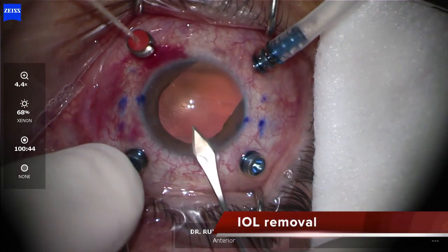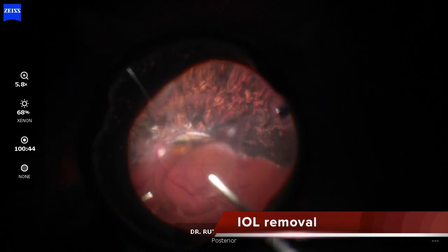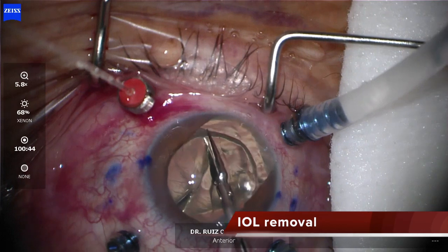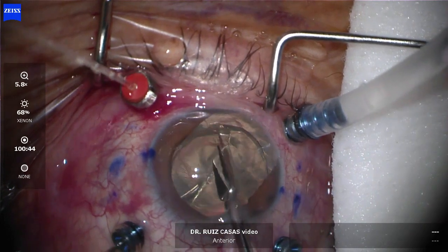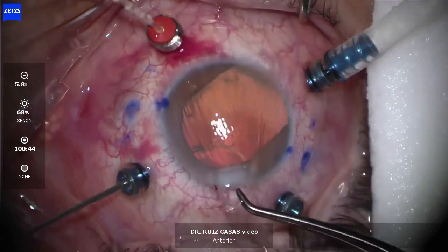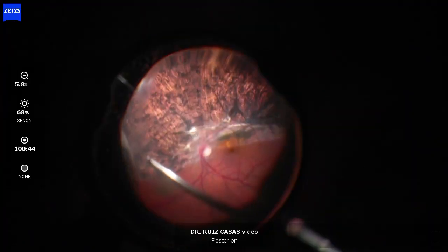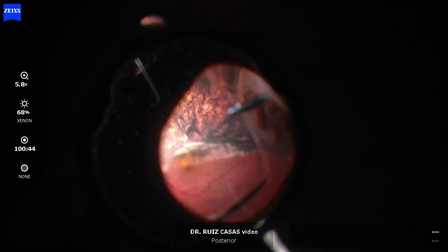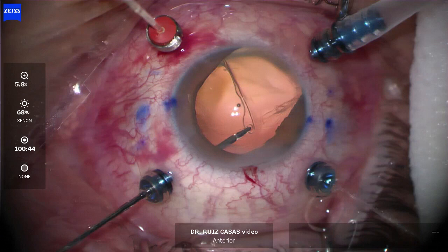When you do phaco with these cases with zonular dialysis, there are always remnants in the vitreous cavity. Now I'm removing the lens by cutting it into halves, and after this I'm also removing the remnants of the vitreous in the periphery as well as the capsular tension ring.